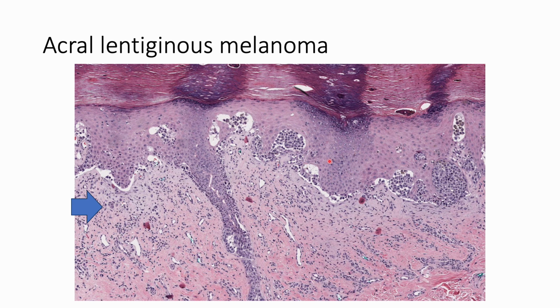It's not a real separation, it's just a histological separation. That's why you don't usually see bullae in melanoma. But here, not only do we have in situ melanoma in the acral skin, but also we have the invasive part. So this is acrolentiginous melanoma. Again, if we cover this area without invasion, we just call it acrolentiginous melanoma in situ.